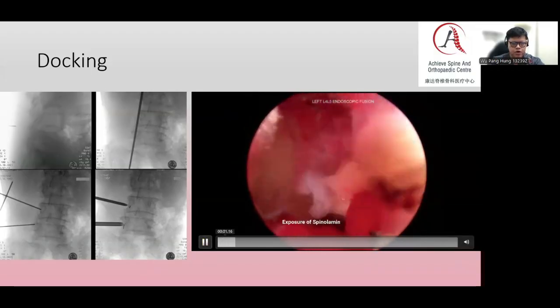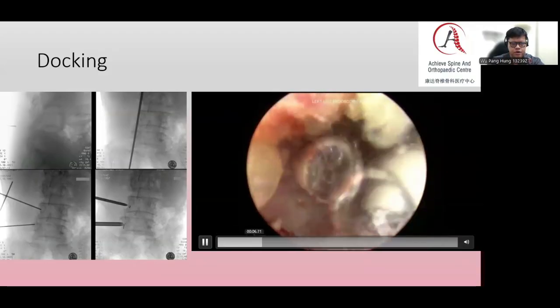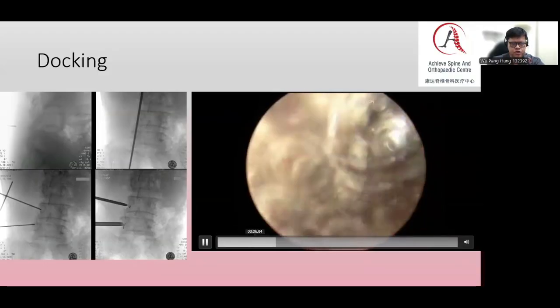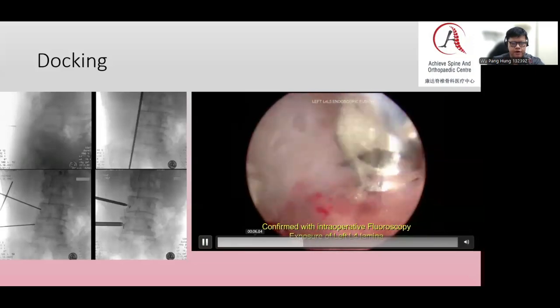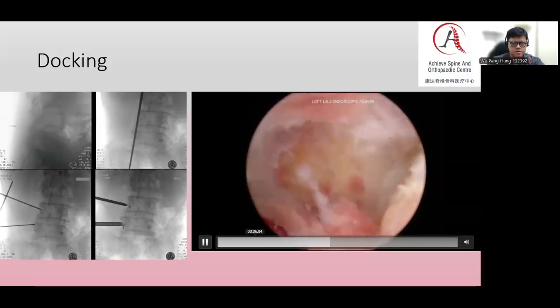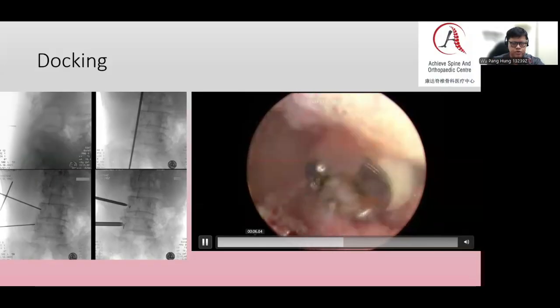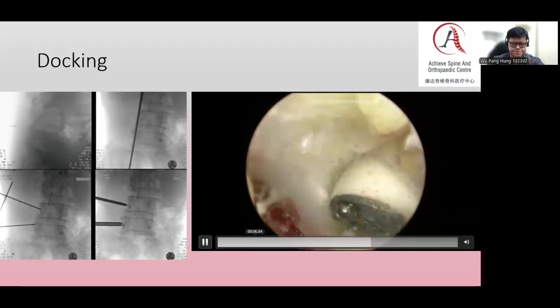We first dock at the spinolaminar junction, and then we expose the facet joint with the large radiofrequency. Then we identify the spinolaminar junction, Wood's point, and then the lateral part of the facet joint between the superior and inferior articular facet, Kim's point in our paper.